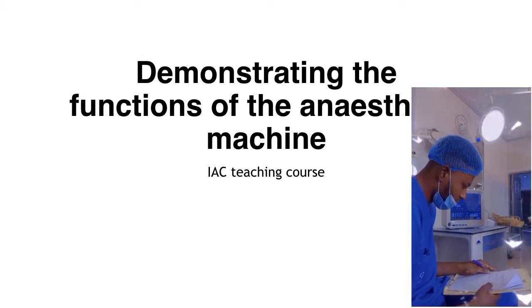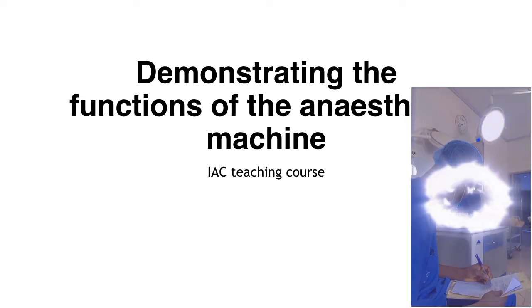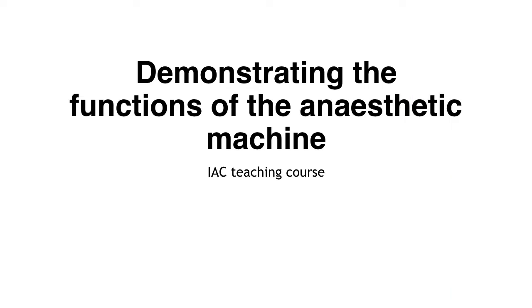Welcome to another lecture in the Novice Anaesthesia programme. Today's talk is going to cover demonstrating the functions of the anaesthetic machine.